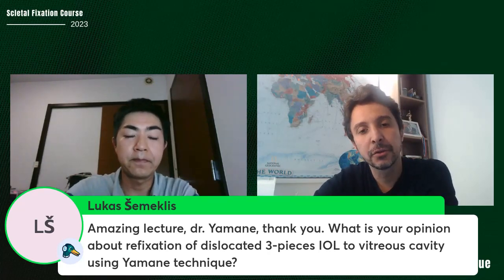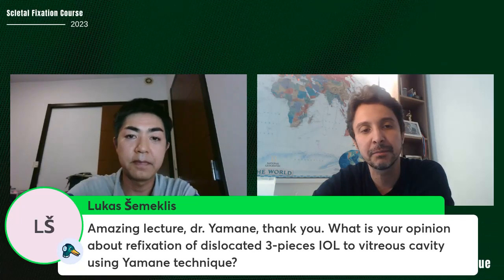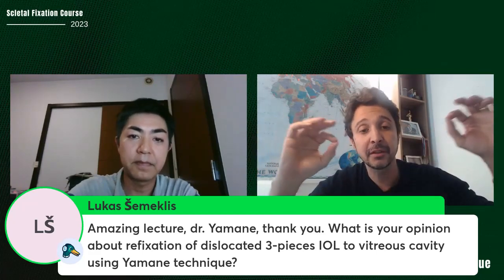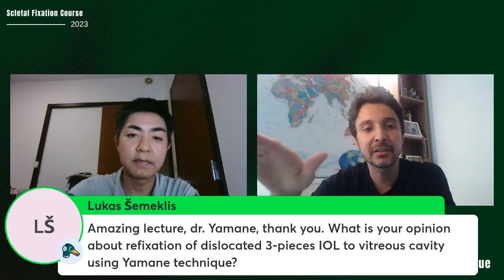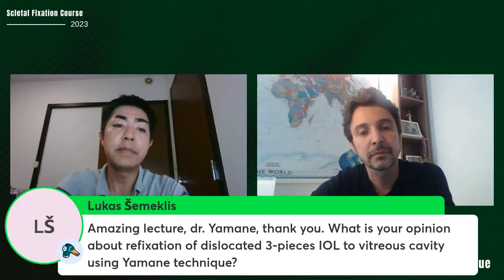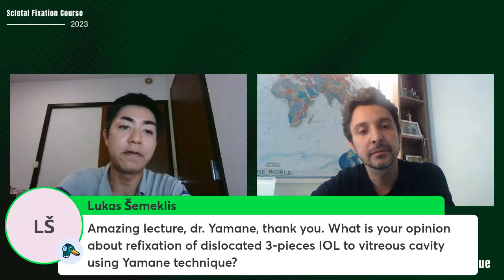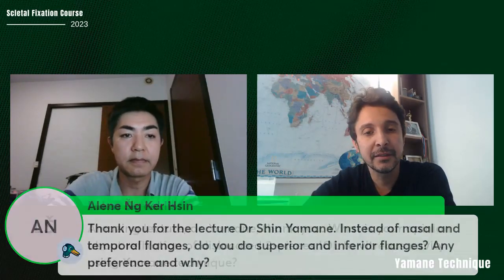Yamane, I like to do this when I have, for example, a patient with a subluxated lens, Marfan syndrome, patients like this. I like to use a three-piece IOL, and I capture the optic and put the haptics in the sulcus. So in the future, if I have a subluxation, I will use your technique. That's okay, because the haptic is not deformed. Yes. Next question, please.